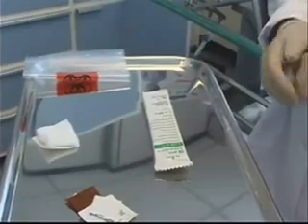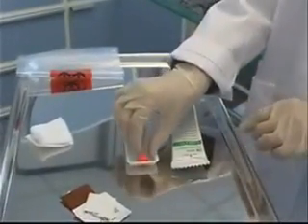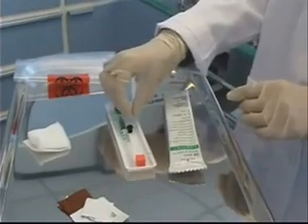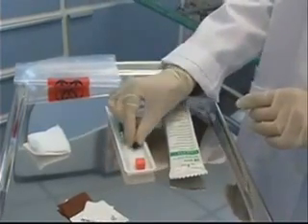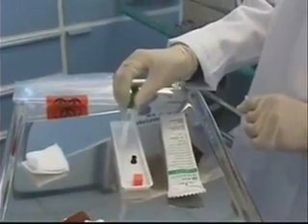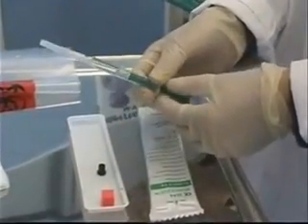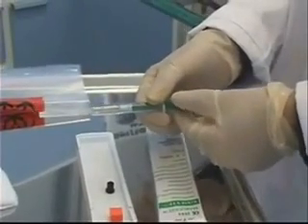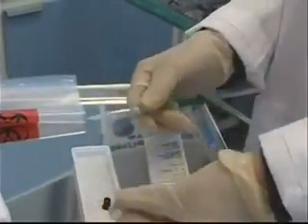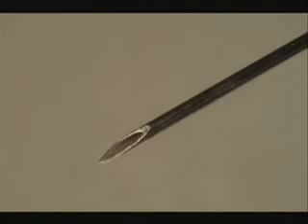While I'm waiting for the skin prep to dry, I can open my blood gas kit. The kit is made up of three different pieces: an orange air ball, which I'm going to use to expel any excess air from the syringe; a black cap to go over the syringe for transport to the lab; and a 3cc heparinized syringe with a needle attached. I'm going to pull back slightly on the plunger so that once I've got the needle in the artery, it will be able to push back to fill the syringe with pulsations from the artery. I'll slide the cap off the needle and confirm the bevel is visible so I can insert the needle bevel-up through the skin.